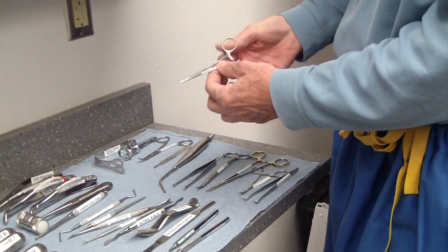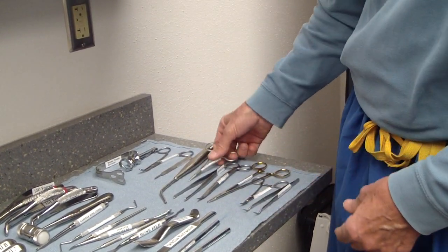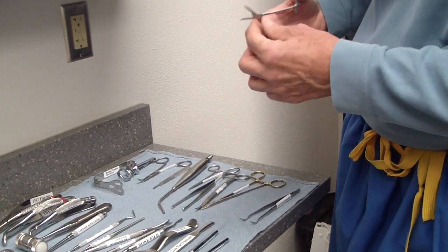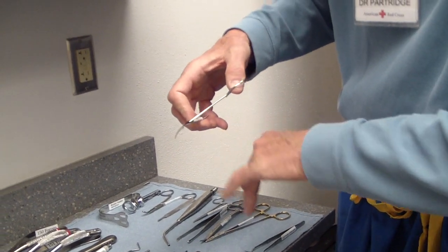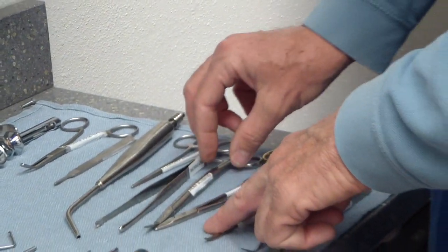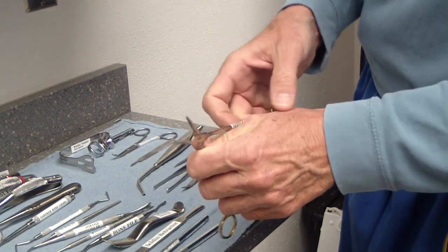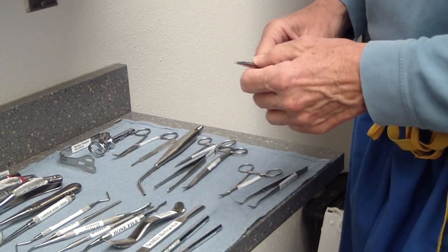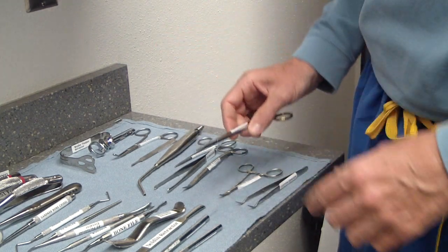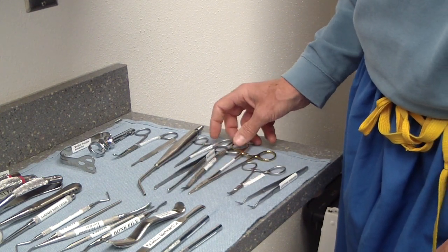We have a number of hemostats — the straight hemostat and the curved hemostat, which has a little tip for getting into tighter areas. The hemostat has a straight serrated nib. The needle holders look pretty close, but the nibs have a crosshatch pattern so they grab the needle at any angle. That's the key difference: the hemostat has simple serrations and the needle holder is crosshatched.